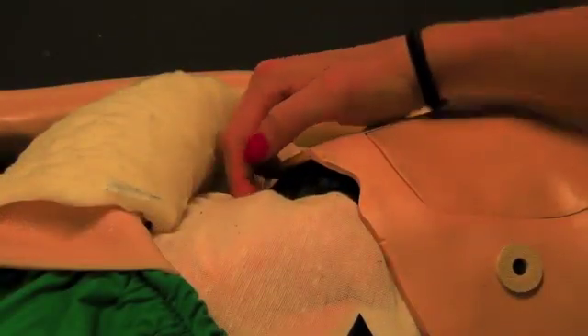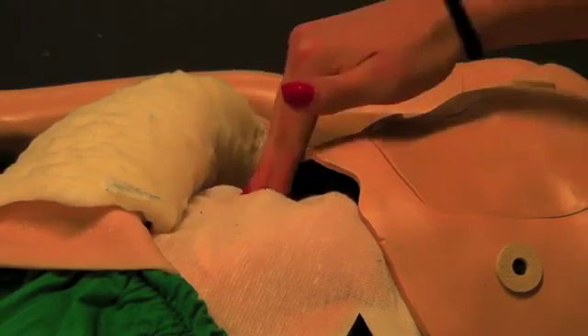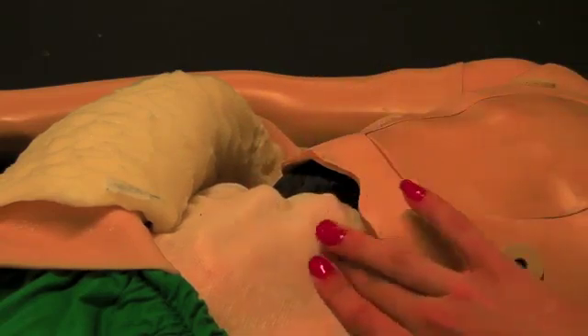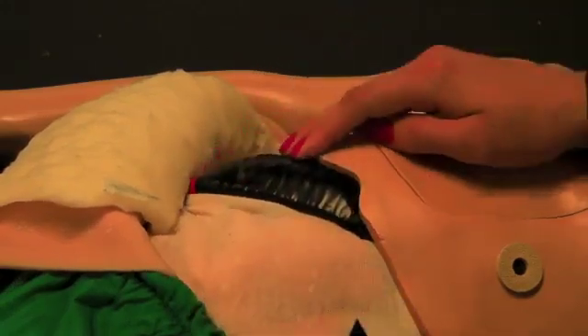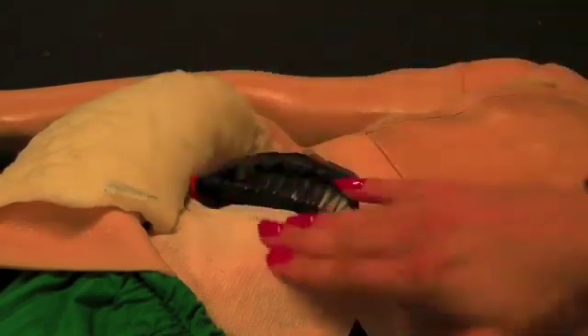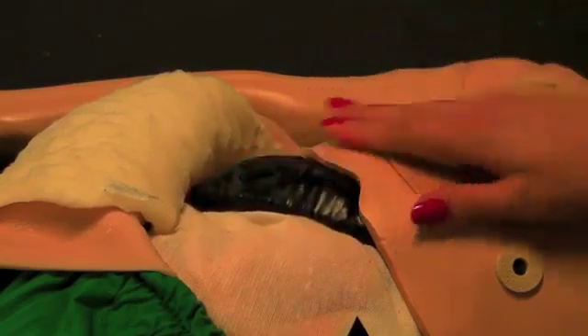Right now the liver is in the normal state. It is not enlarged, but it is still palpable underneath the ribcage, one to two centimeters. The liver can be enlarged up to five centimeters — this would be the largest enlargement state. You can see there's a material underneath that keeps it from pushing down all the way.